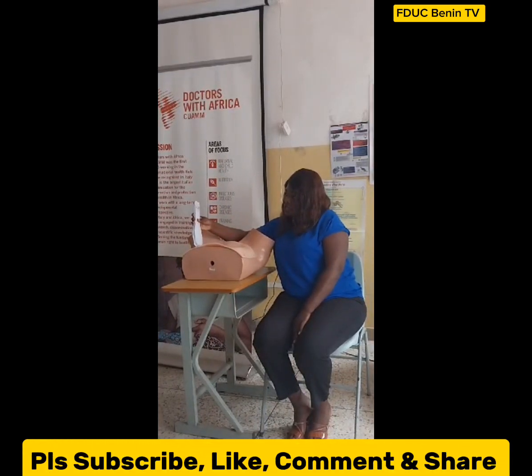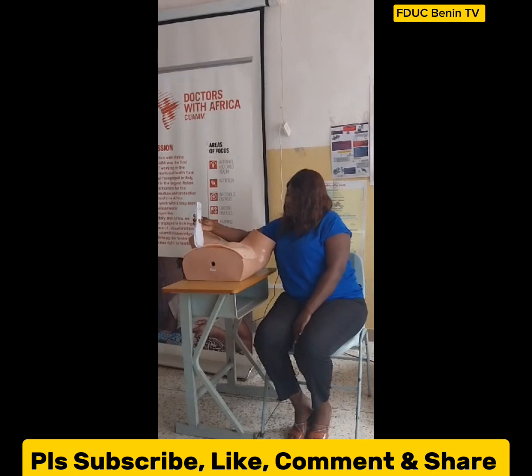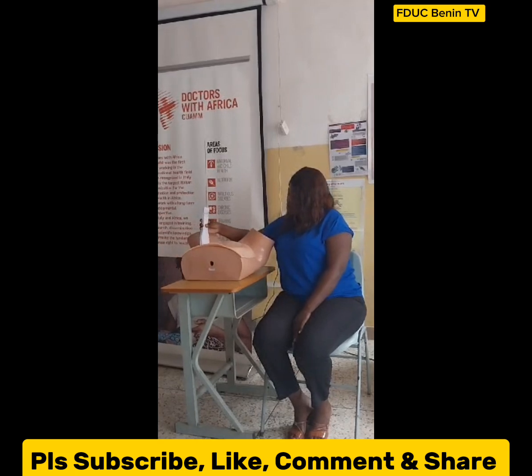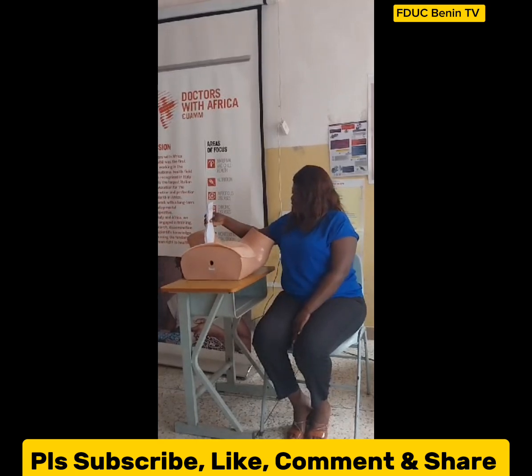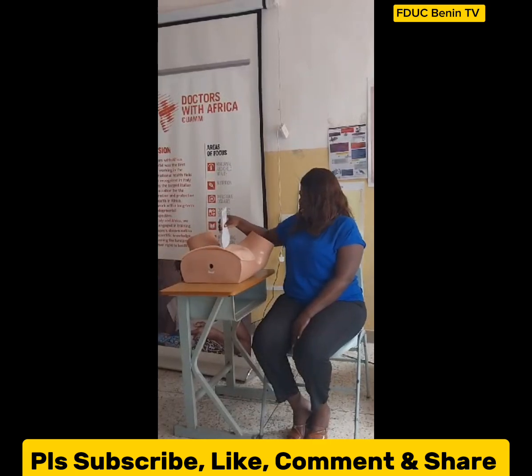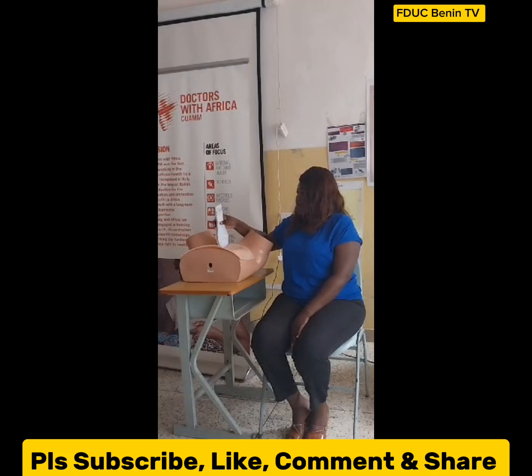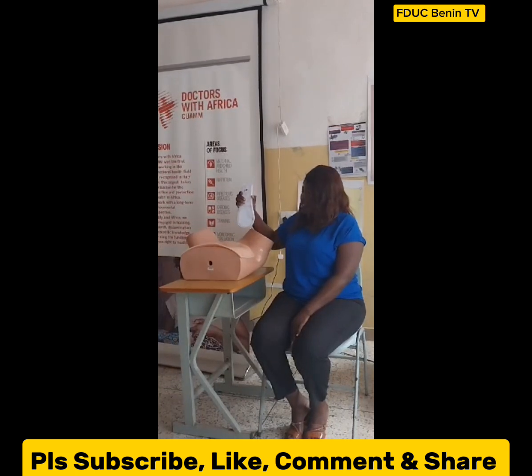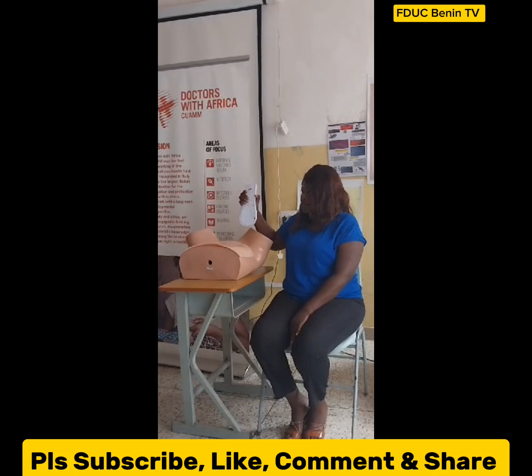At the broad axis, I'll slide on the maternal left. I'll slide on the narrow axis towards the maternal pelvis. Then when I get here, I'll slide on the broad axis towards the midline. At this point, I'll then lift the probe for the first time, and then I'll rotate anti-clockwise 90 degrees.